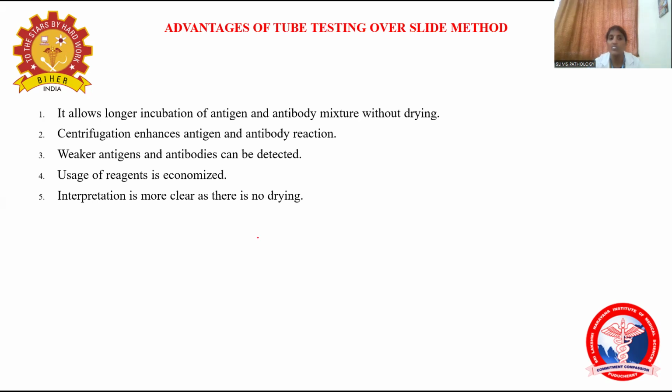And usage of reagents is economized, obviously. And finally, interpretation is clearer because there are no drying artifacts here. So these are some of the advantages of tube testing over the slide method.